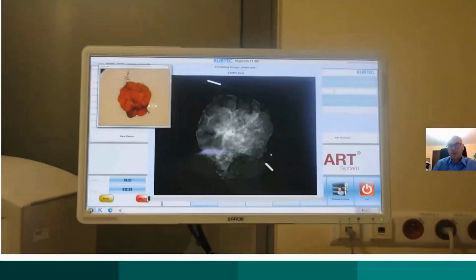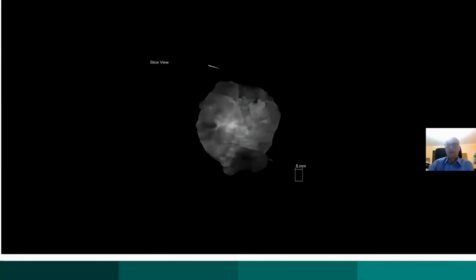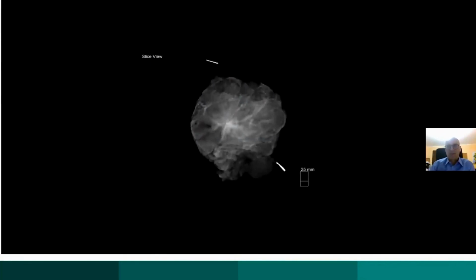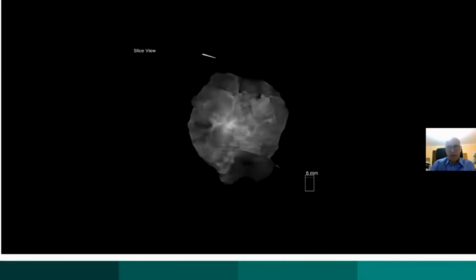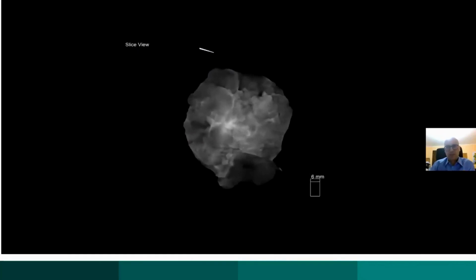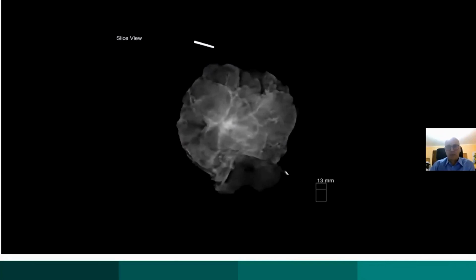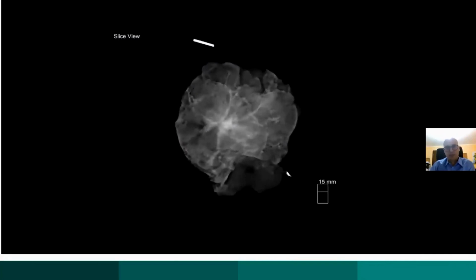Well, then the surgeon approaches the screen and assesses the excision margins. As you can see, the specimen is sliced from up to down. I usually try to place the specimen skin side up, but sometimes I perform another tomosynthesis images with the specimen placed on the side.